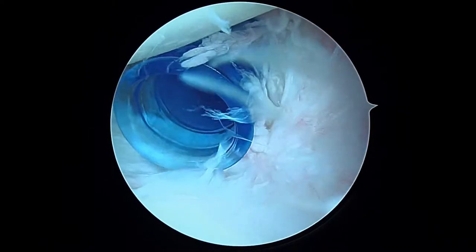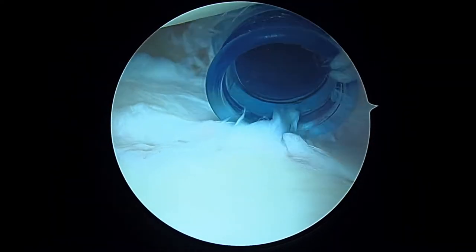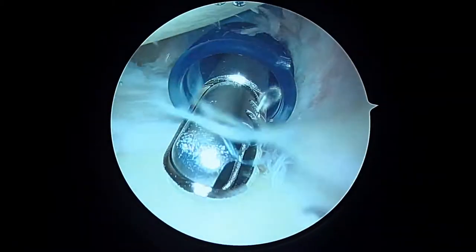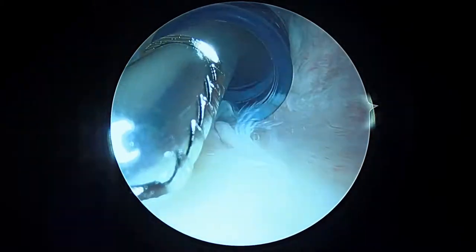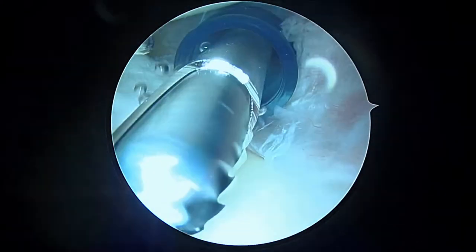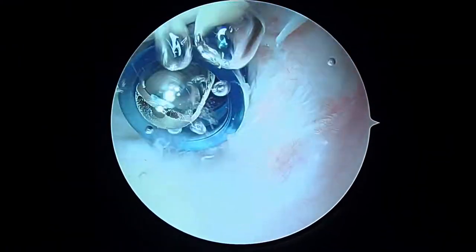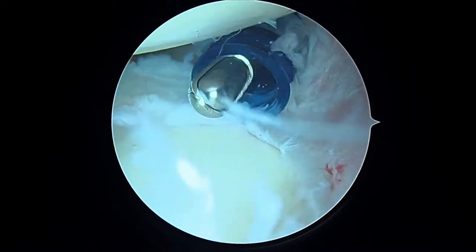We're just getting started on the left shoulder, looking from the back to the front. Everything you see is magnified 30 or 40 times on the screen. We have a blue-ish cannula coming in the front of the shoulder. We'll turn on the suction and the shaver attached to this cannula because it will remove some of the torn labrum and allow us to see what's going on with this biceps tendon, which is first on our list to assess.